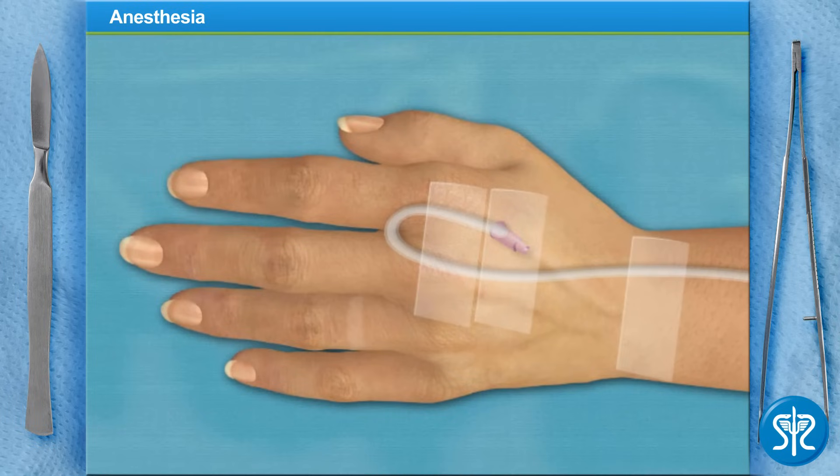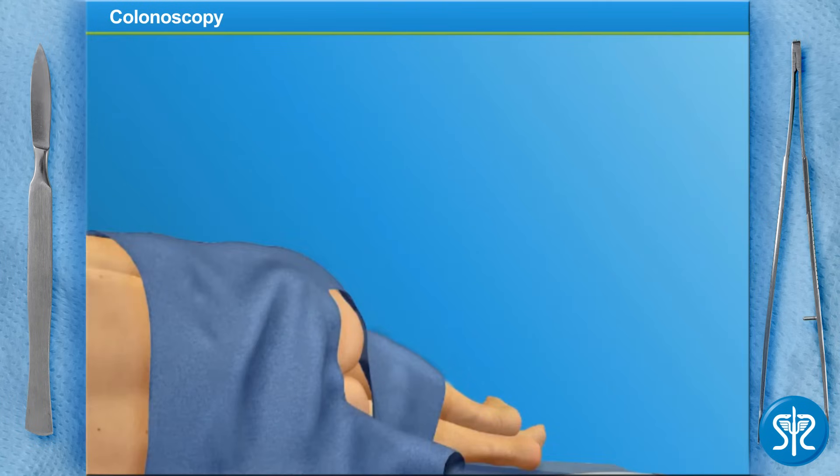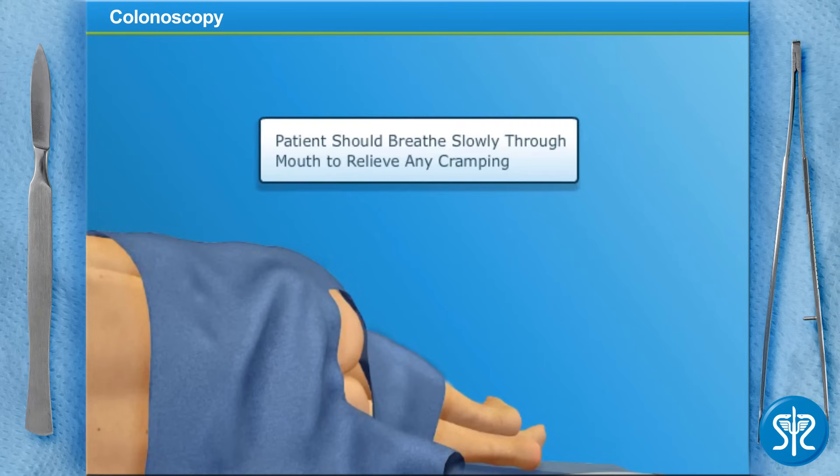We'll wait a few minutes for the sedative to take effect. Our patient is sedated and ready. She has confirmed that she's cleansed her colon, and I've already used a lubricated gloved finger to check for blockage. Be sure to tell the patient to breathe slowly through her mouth to relax her stomach muscles if she feels cramping.